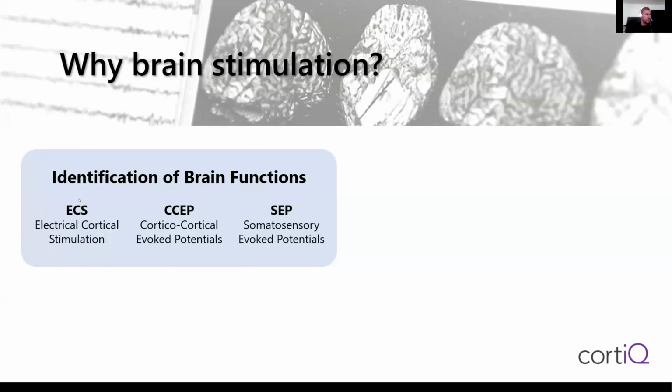So we will have a symptom, for example, blocking speech, like aphasia, or we can execute motor functions, or we can also inhibit ongoing motor movement, and by that better understand how the cortex can be characterized into functional brain regions.